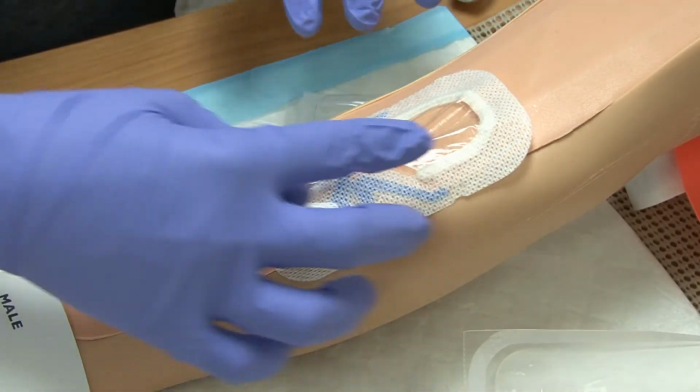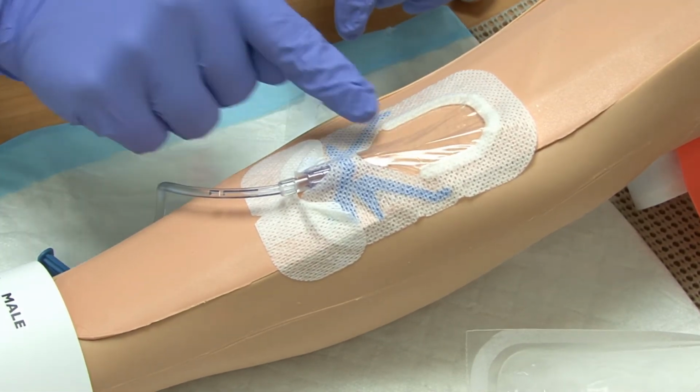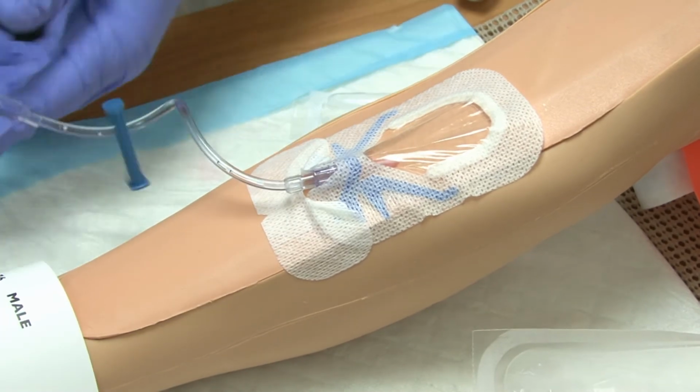All right, so we had put the securement device down, and as we said, you want to make sure that you can see the actual insertion site through the window, and you want to be able to see the colored hub so you can tell what gauge it is. Now, once I've got this on here, then I can come back over here because I want to clamp this.